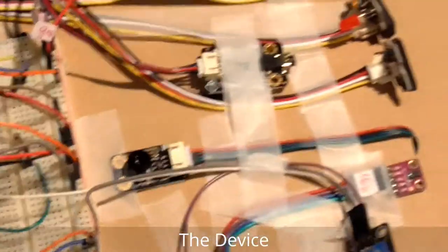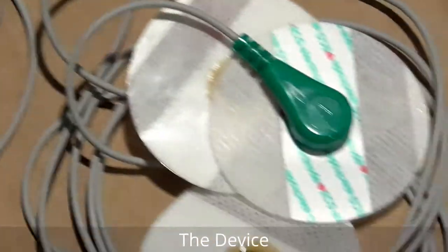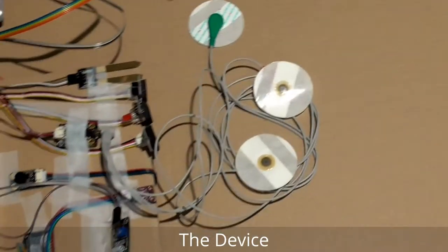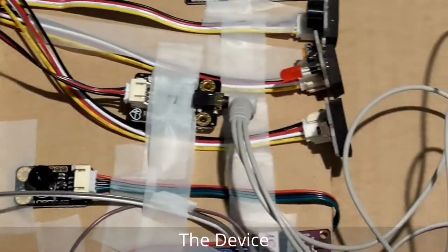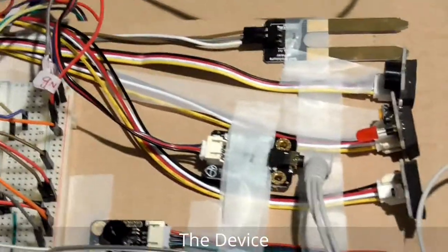One thing that was missing — I'm coming back to show you this sensor. Now you can see the ECG sensor is connected with cables. These cables need to be placed on the patient's body to measure the ECG rate of the heart. This sensor gives the wave pulse of the heart.